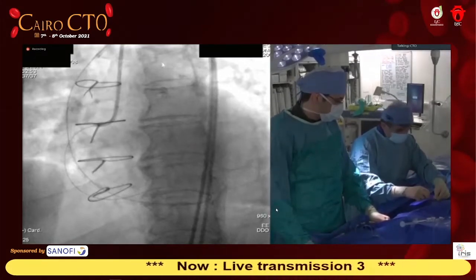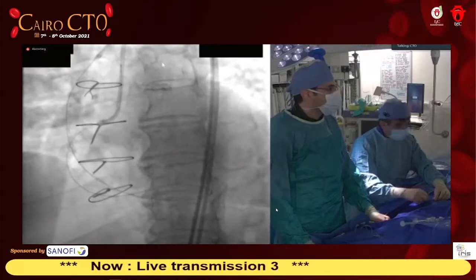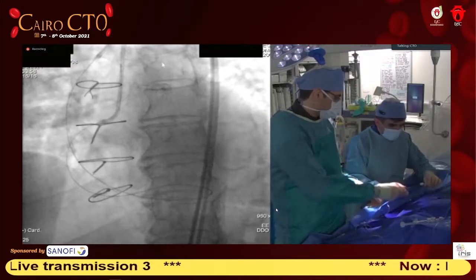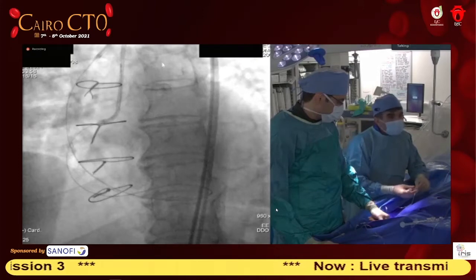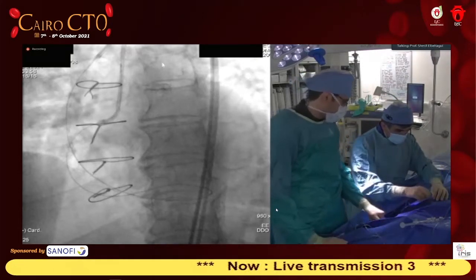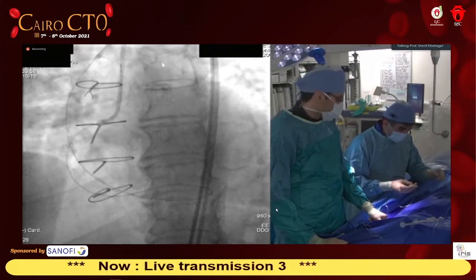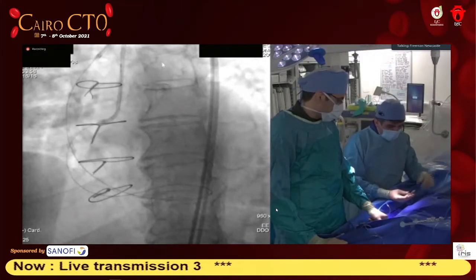Dr. Hadi Abu Handish gave hello for you, and he would like to ask, would you leave the saphenous vein graft? Well, this is the question I posed to you guys before. Once you've opened the native, what would you do? I would leave it, actually. It will take care of itself and close soon, I believe. Yeah, I mean, this is the controversial issue. This is why I chose this case.